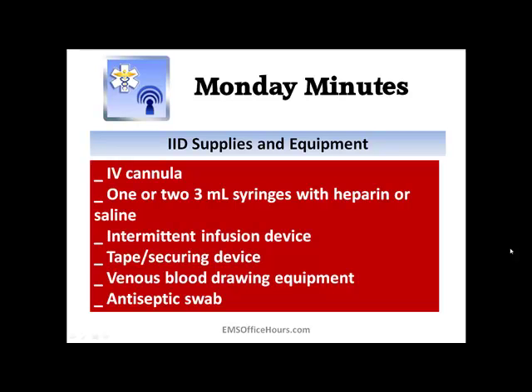And of course, you're going to have your antiseptic swabs as well, whether it's Betadine or alcohol, the iodine, whatever the case is, whatever you use to cleanse the site and cleanse med ports and stuff like that. Okay, and that is pretty much it.